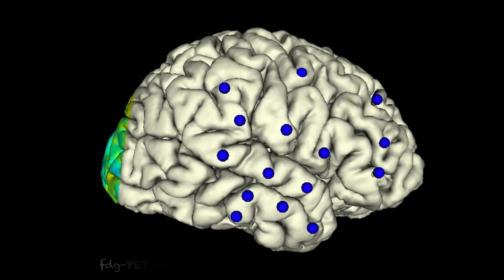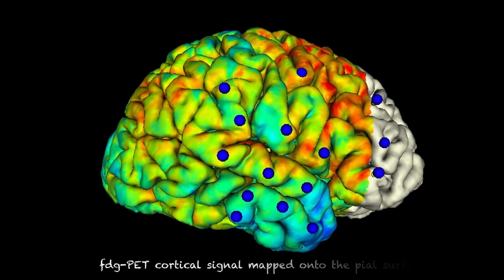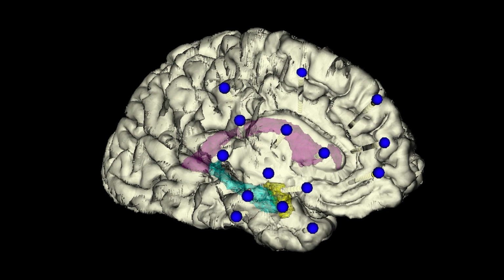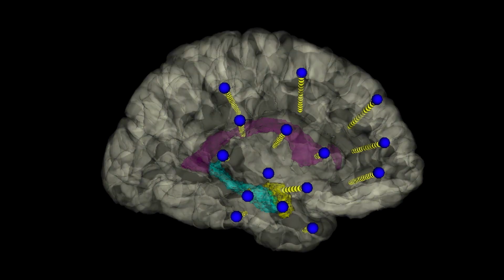Reluctance to consider MR negative cases for surgery was progressively mitigated by evidence of epilepsy-related focal abnormalities provided by novel diagnostic tools, including PET scan, image processing, and high-density EEG. These tools frequently provide additional working hypotheses, thus expanding the areas to be covered with electrodes.